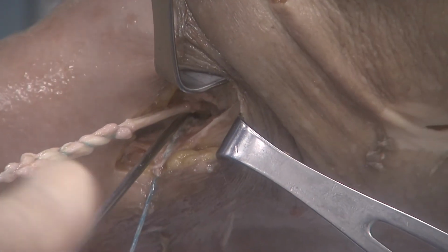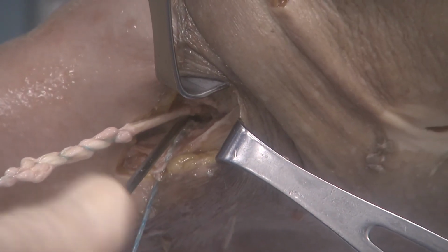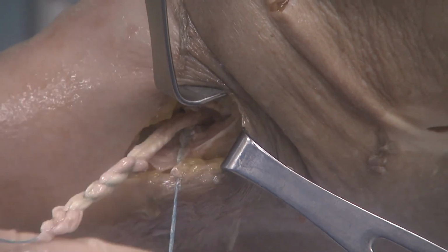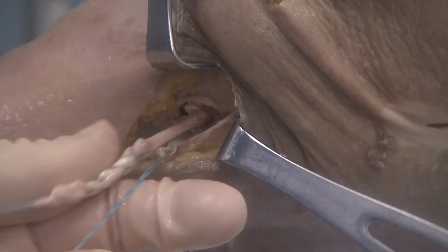And then to remove this, we just simply twist it, and it'll disengage from the implant itself. And then we can cut our tendons at the tunnel entrance point. We have a completed posterior lateral corner reconstruction. So we've created a very stiff construct, and we have more than adequate fixation strength.